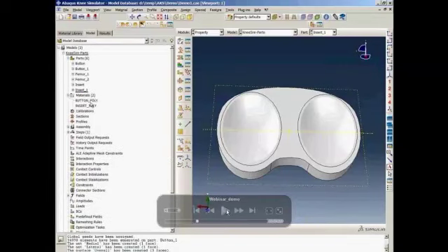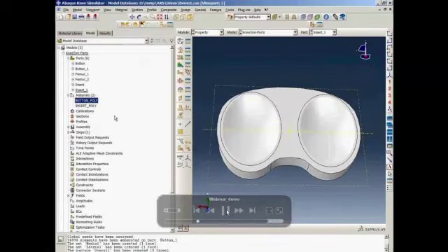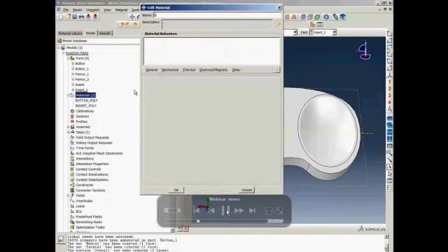Abaqus Knee Simulator provides a few material models as built-in materials, but the user can always create their own materials based on material test data. This is a demonstration of how to do that, and of how those materials can be used by Abaqus Knee Simulator. In this case, we will create a Drucker-Prager plasticity model, which has been used a lot in modeling the polymer insert. The built-in model is a simple elastic material. So now we create a Drucker-Prager model.